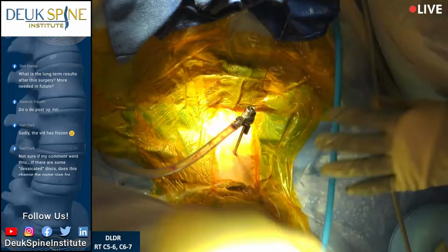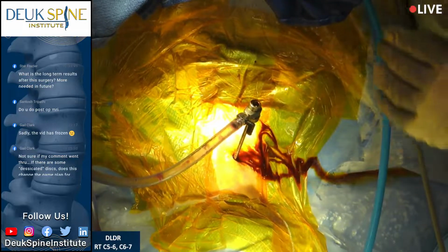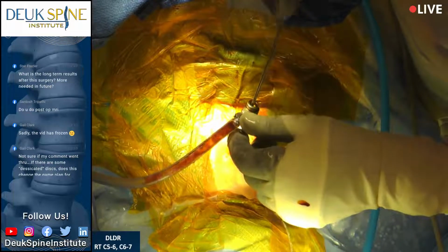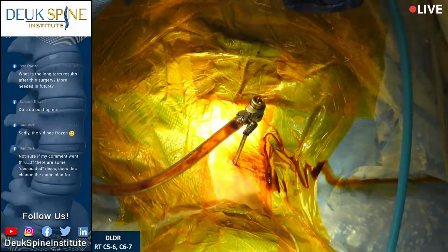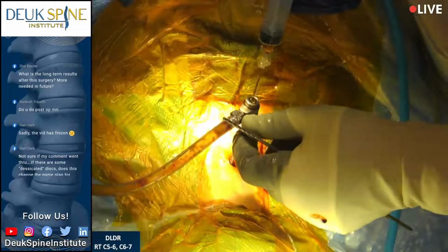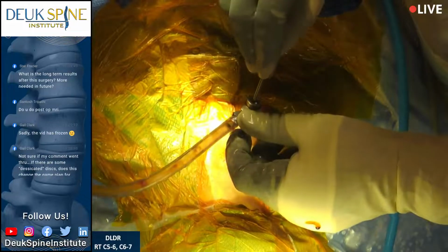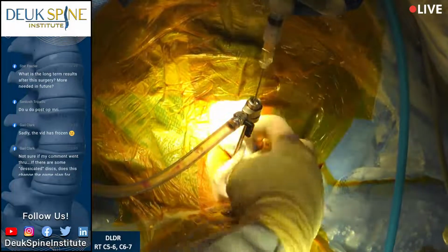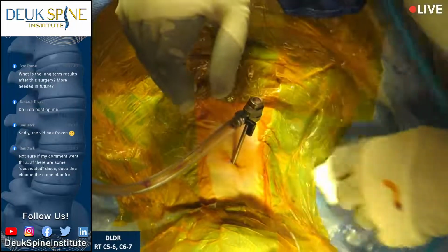Can you see, Flynn, the tube here? I hope you can. But basically, that's a little antiseptic. We give it at the end of the disc repair. That way we don't ever have any infections. We're going to irrigate it out now. It's actually betadine, which is commonly used in surgery as an antiseptic. Developed by NASA, which is just literally down the road, 10 minutes from us. And it's the best antiseptic we have available. That's why we use it. It's very safe as long as you don't have an iodine allergy.